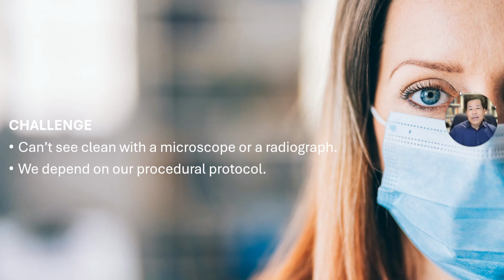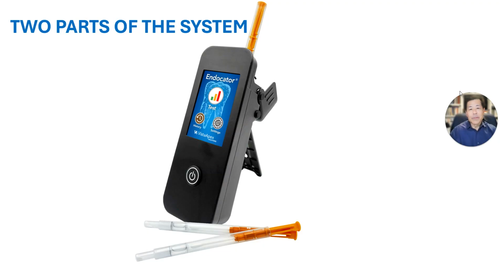What's the challenge? Is that we can't see clean with a microscope or with a radiograph. We are dependent on our procedural protocol. What file system we use, how we step up in our file size, how large of a file we end with, our irrigation, what type of irrigants we use, how long we use those irrigants, the volume of irrigant that we use, do we activate the irrigant or not? There's a lot of variables. And that's why I think some of us do good root canals, and yet if we leave any bacteria behind or a little bit of tissue, it fails to heal. And that is not a good thing for either us or our patients.